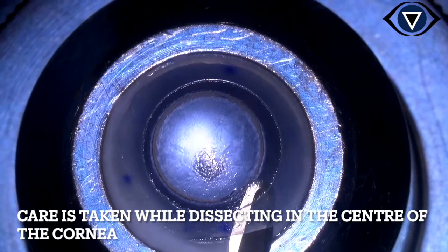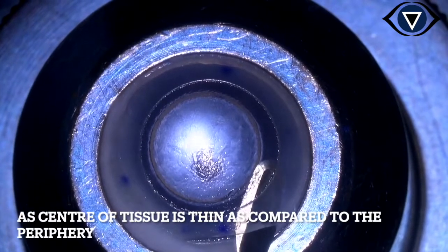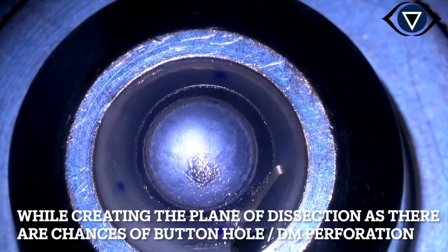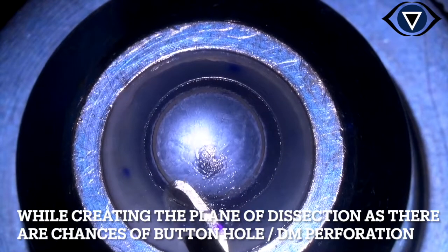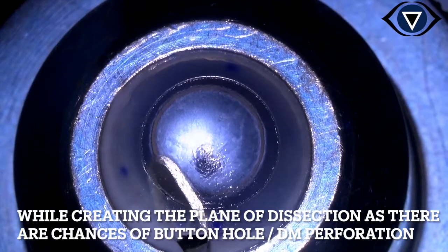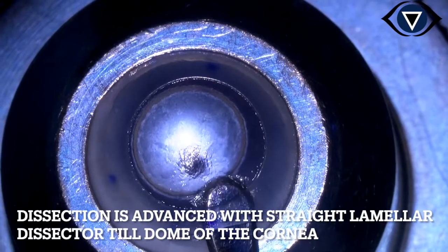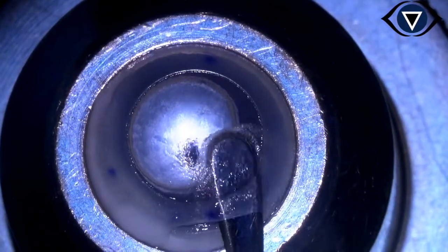Care has to be taken while dissecting this tissue because there is differential thickness in this particular donor cornea, where the center is thin as compared to the periphery, which is comparatively thicker. We have to be careful while creating the plane of dissection because there are high chances of buttonhole or Descemet's membrane perforation because of this differential thickness in the center and periphery. The dissection was advanced with a straight lamellar dissector till the dome of the cornea, like it is done while harvesting a normal DSEK tissue.